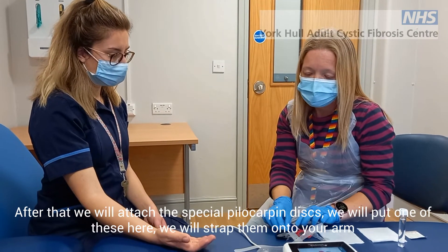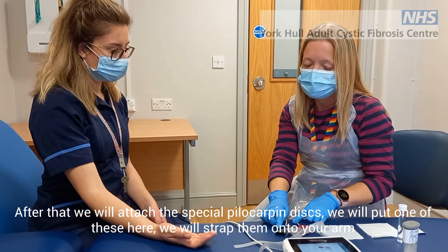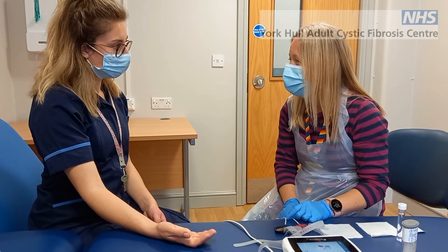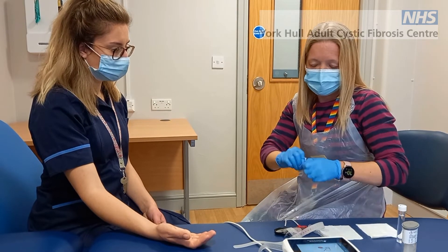After that we're going to attach these special pilocarpine discs. We'll pop one in each of these, strap them onto your arm, and then that'll stay on there for about eight minutes. So we'll make a start.